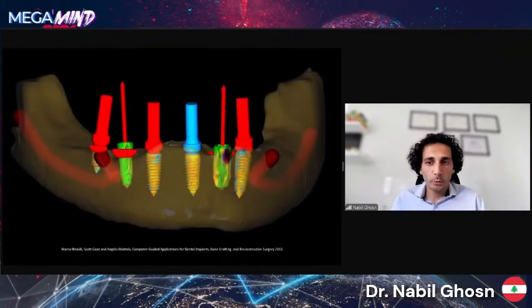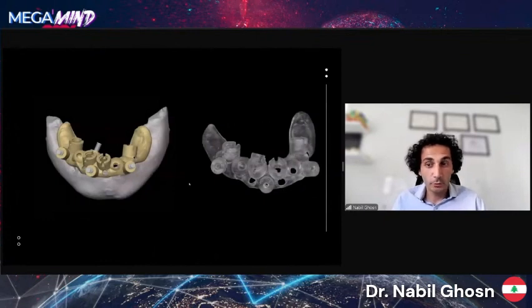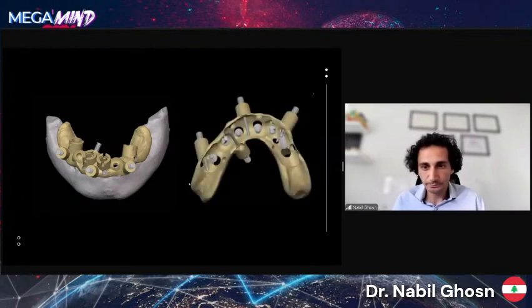In our treatment plan, we wanted to do this case guided, but with a flap approach, because we wanted to treat our old implants, to do a GBR on implant number 46, and because we also had a proximity with the anatomical structure, so it would be safer to do it with a flap. So we decided to do a new guide design that can accommodate a flap without having to be bone supported in order to reduce the post-operative morbidity from extensive flap reflection.